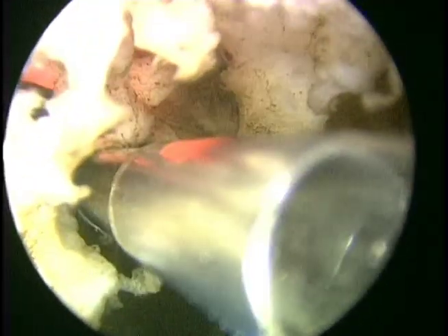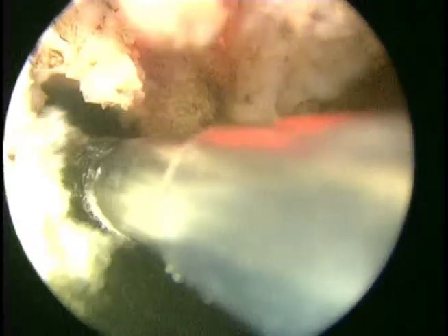Here we have treated the majority of the floor and left lateral lobe. However, there's still a little bit of bleeding anteriorly, and we'll take the time now to address this and continue on with the treatment of the right lateral lobe.